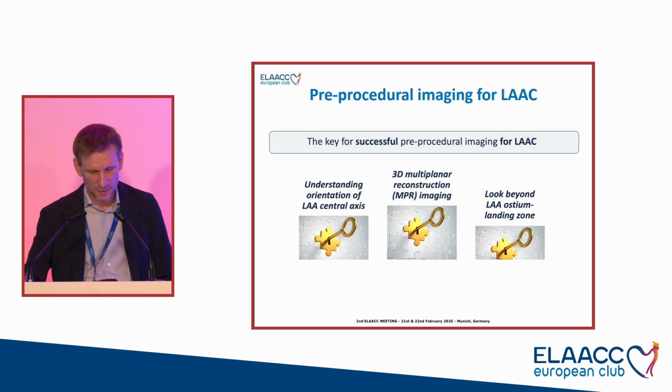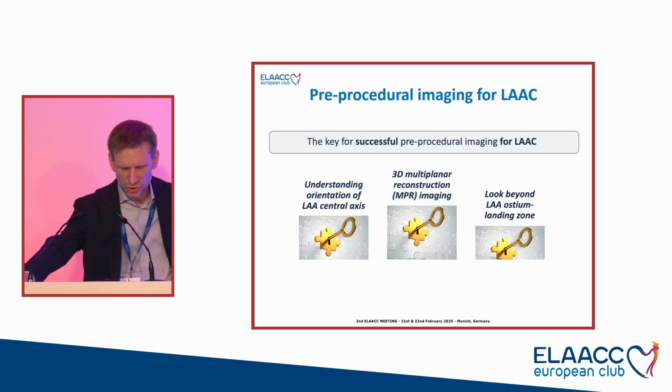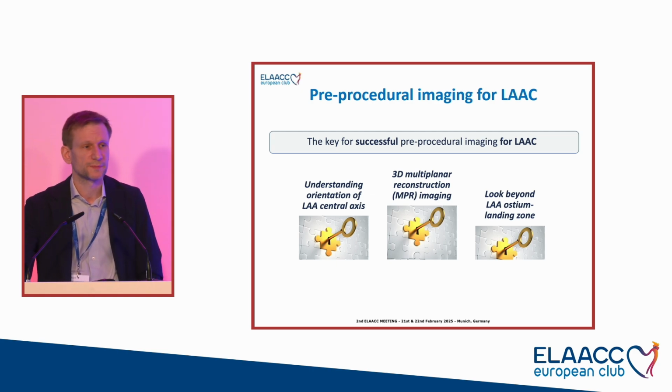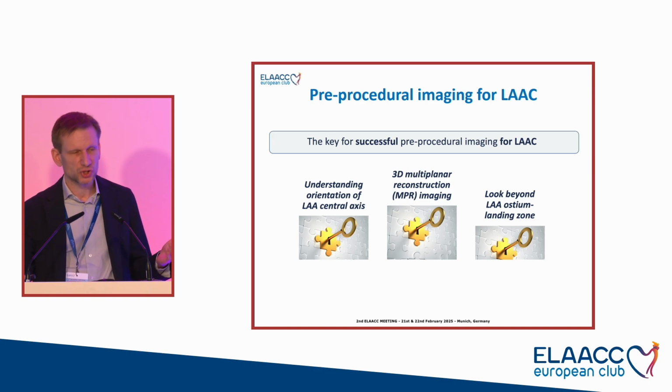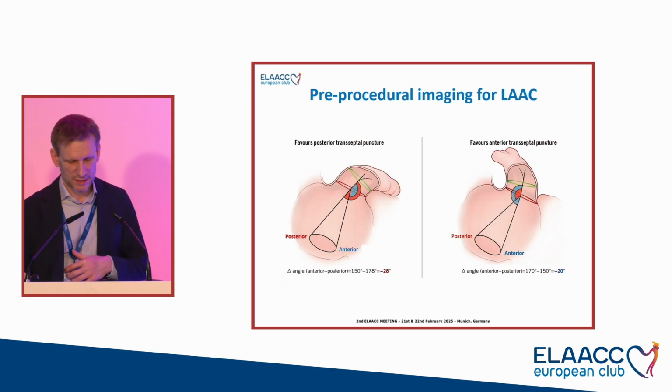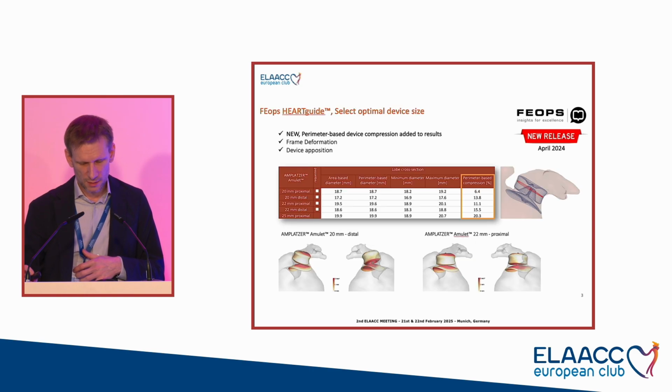And then the other one is understanding the orientation of the appendage. That's also important for your transseptal puncture, typically. Also coaxiality, we know it's really important for the outcome of your procedure. And then looking beyond the LAA ostium or landing zone, I just want to show you, this is the last slide I want to show you. For example, this one.